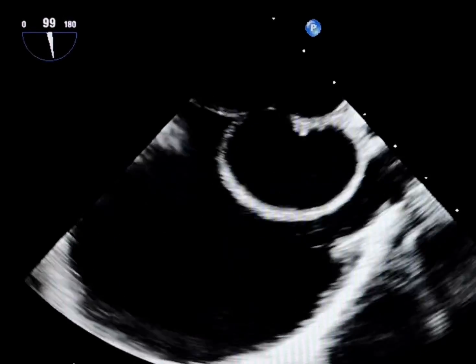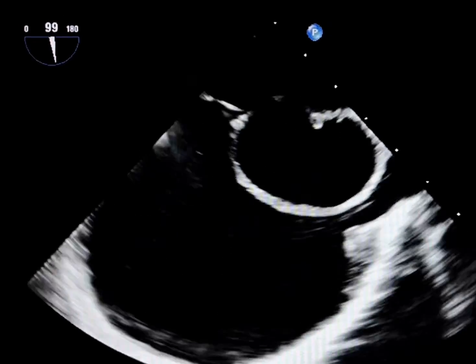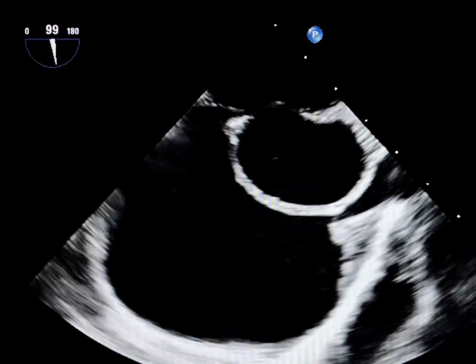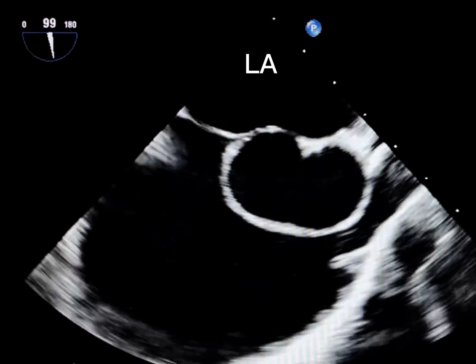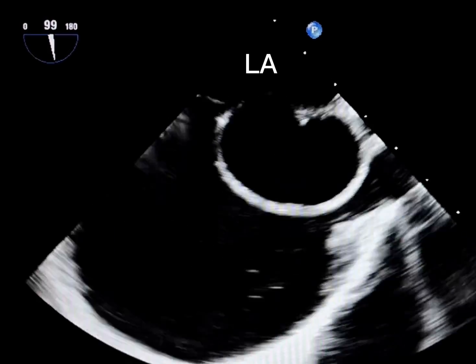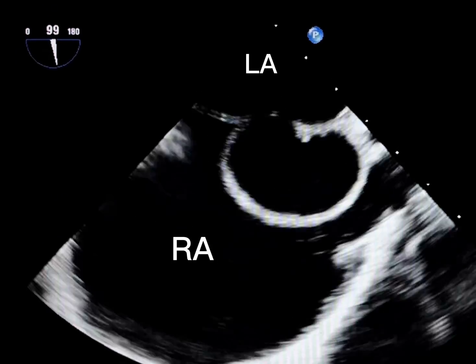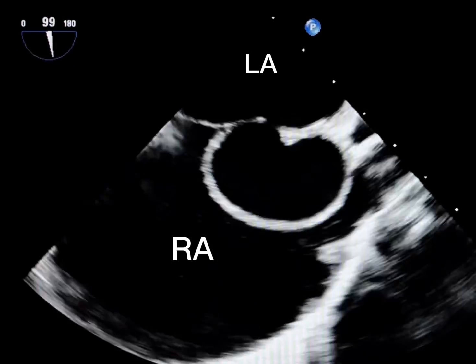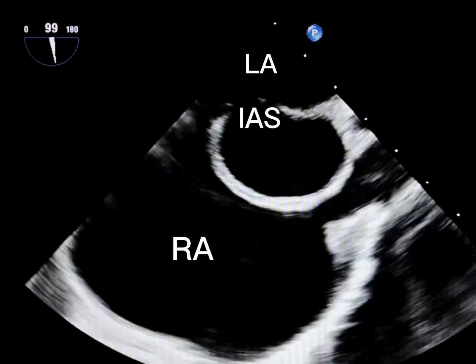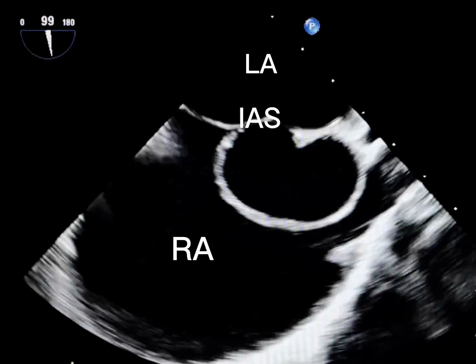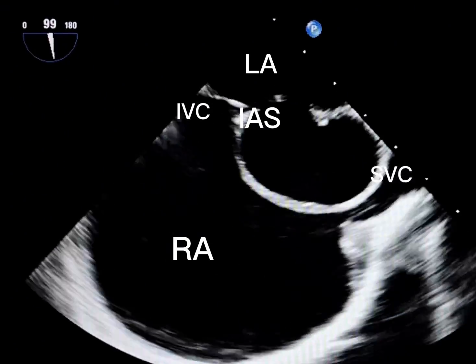In this bicaval view of transesophageal echocardiography, we see the left atrium at the top, the right atrium at the bottom, and the inter-atrial septum in the center, along with the SVC and IVC.